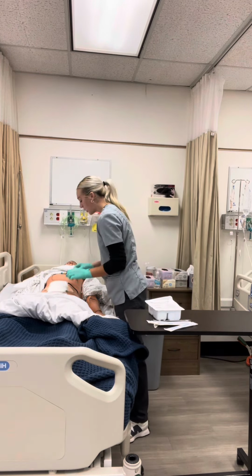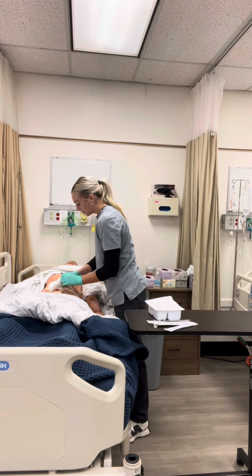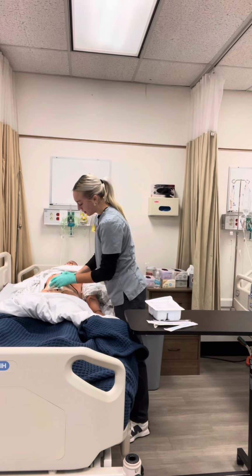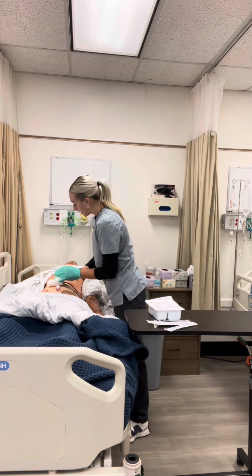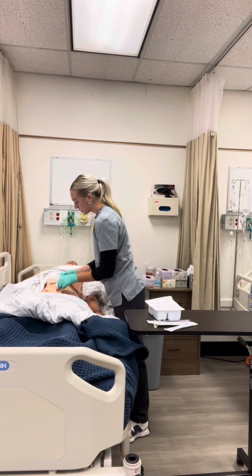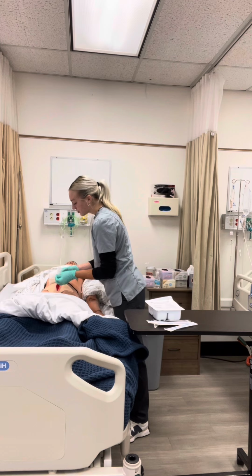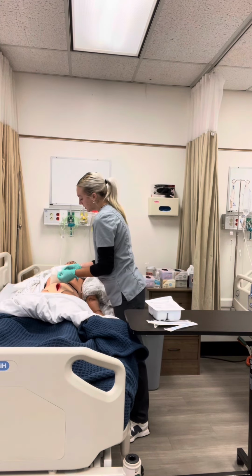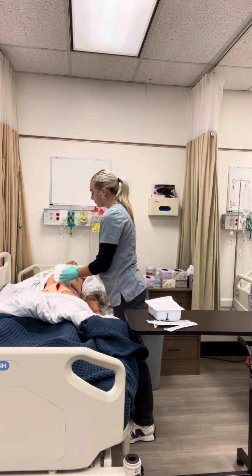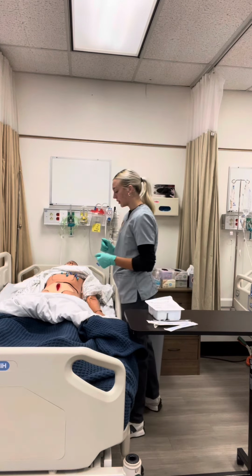Alright, sir, so I am going to hold down the uninjured skin and peel the tape back away from my patient's wound. And I'm going to keep this out of his line of vision. I don't want my patient seeing the soiled dressings. Alright, so here I am looking at the color and the amount of drainage that is present, and I'm going to remember that so I can document it later.